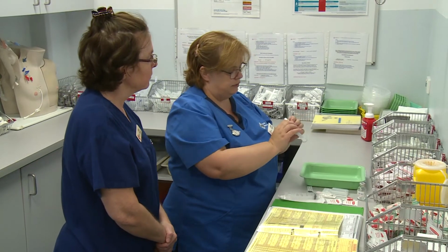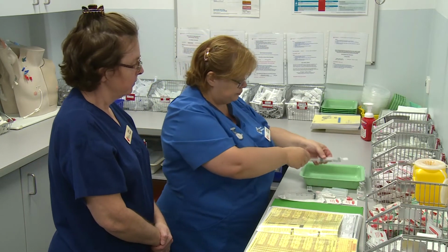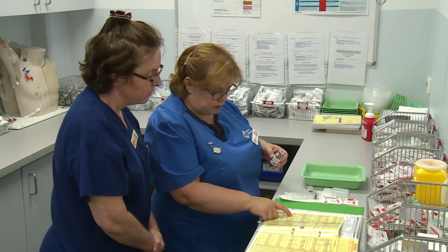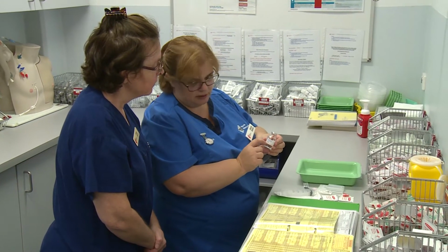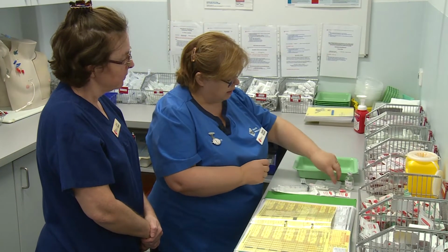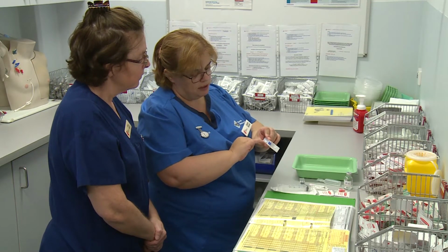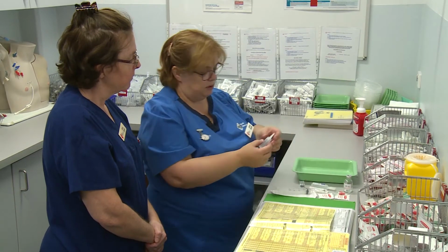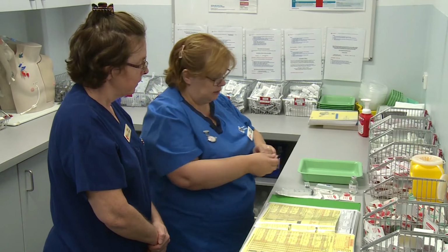I have 0.9% sodium chloride, expires 2022. And that's going to be my post-flush. Amoxicillin 1 gram IV. I have amoxicillin 1 gram and it's for IV, and it expires February 25. Okay, and as per the Australian Injectable Handbook, I'm going to mix that with water for injection 10 mils, expires July 20, and another 10 mils of water for injection, which expires in July 20.